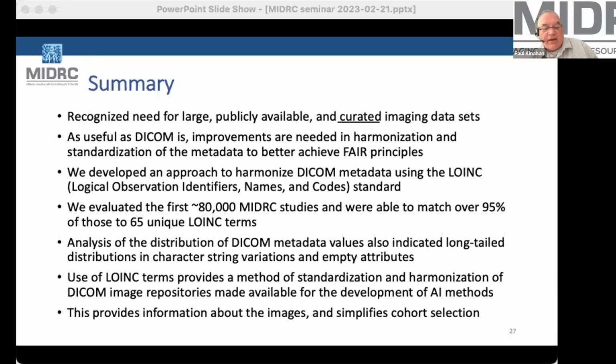I would add that one of the ideal outcomes of MIDRC is if somebody uses it to develop an algorithm that's effective, or somebody uses that to develop a clinical product that's effective and shows that, either develops it or validates it against the MIDRC data.